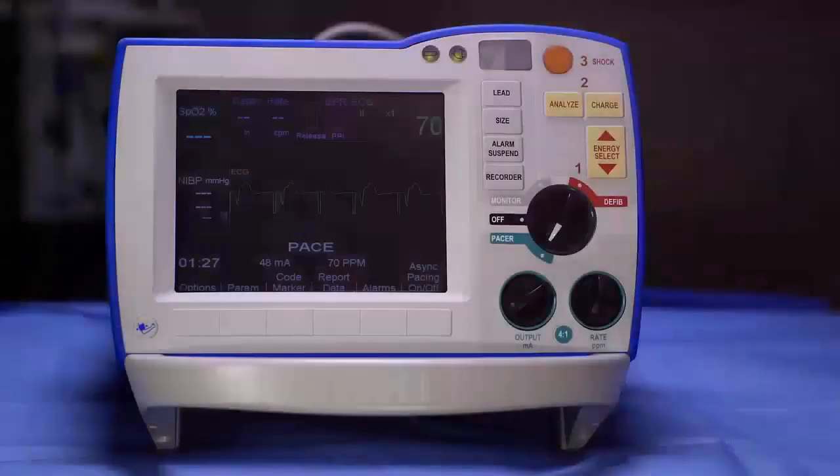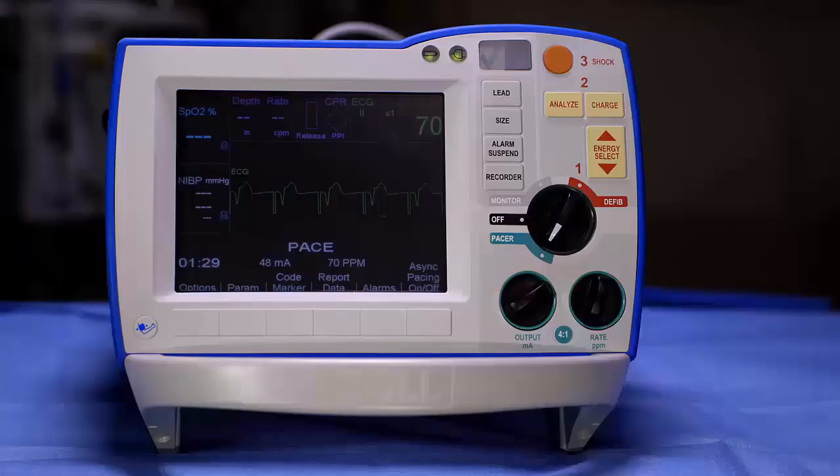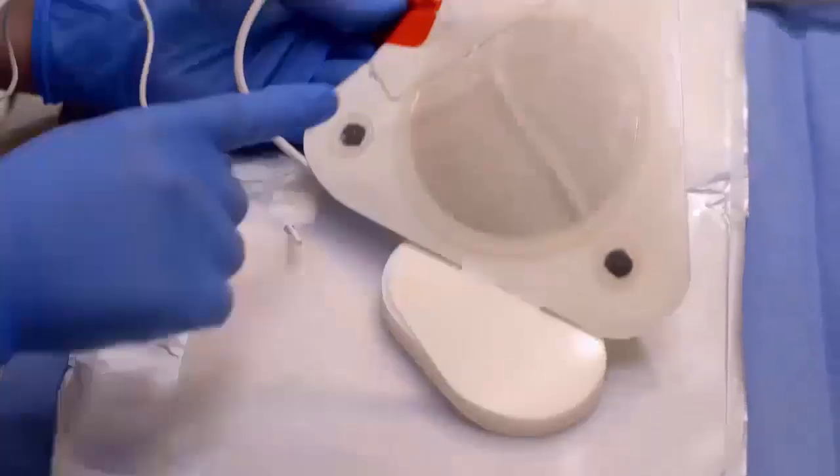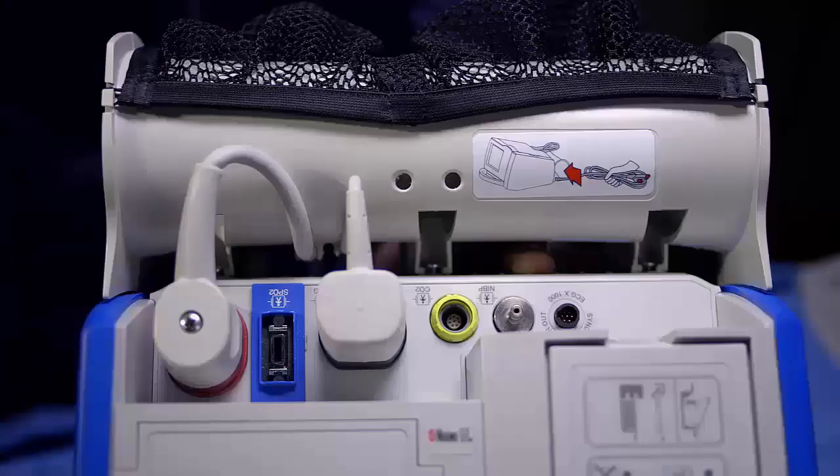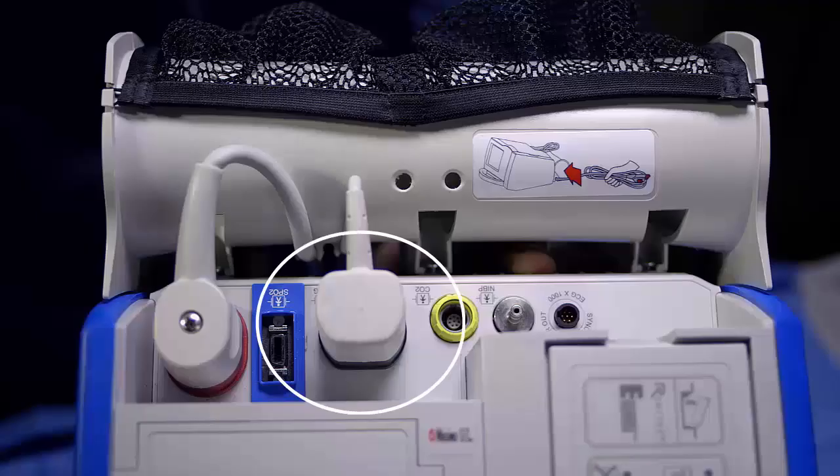Pacing. When the R-series is used with the one-step complete or pacing electrodes, a separate ECG cable is not required because the three leads are built into the front electrode pad. When using one-step pacing or one-step complete electrodes, make sure that the ECG end of the one-step cable in the back of the defibrillator is plugged in.